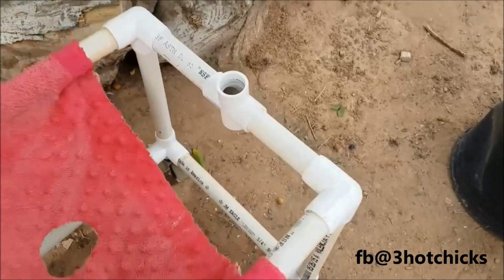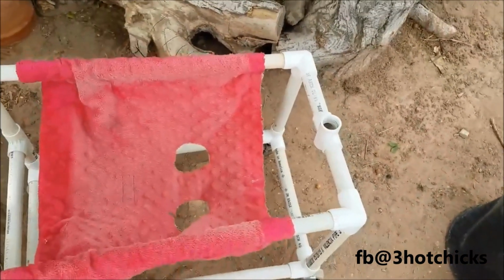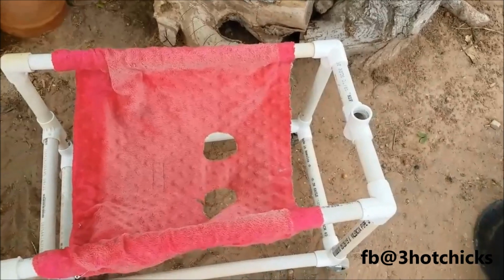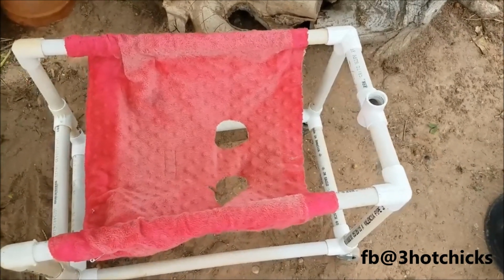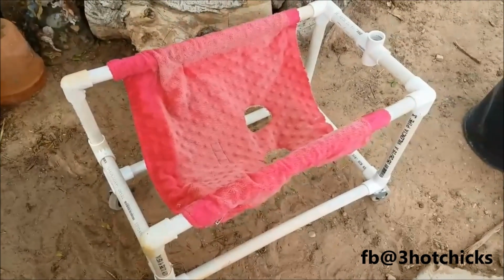And then, like I said, we put a piece of PVC right here. This is the back of the wheelchair, and then that way we use the handle, and I'll show you in the video at the end. I don't know where I put it, but really, it's really simple to make.